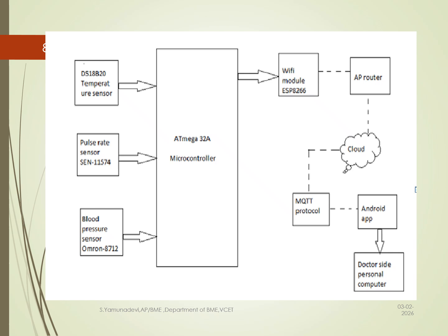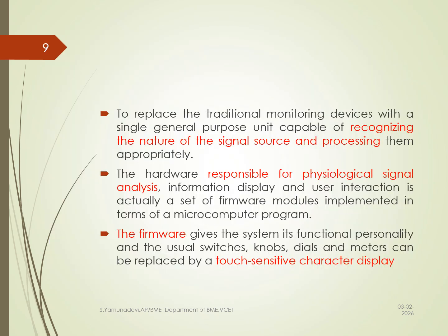Then by using a protocol, the doctor can access it using an Android app. From the doctor's side, it is very useful for 24 hours monitoring of patients. Mostly currently in the market, this type of cloud-based patient monitor is available.